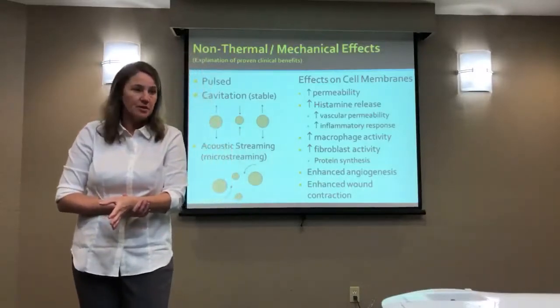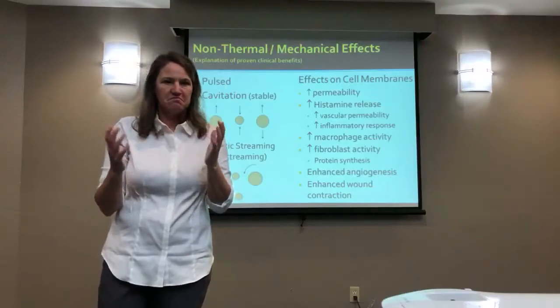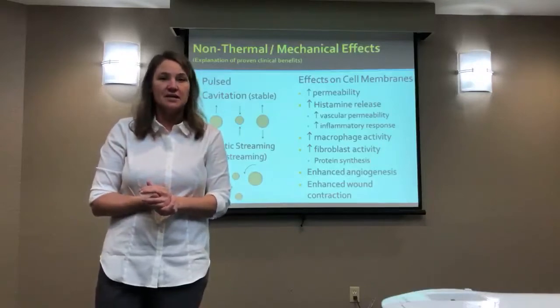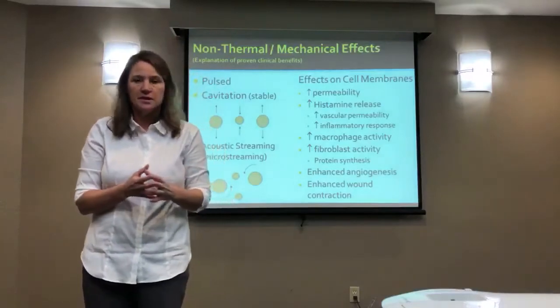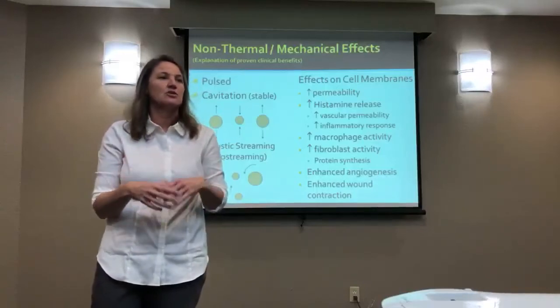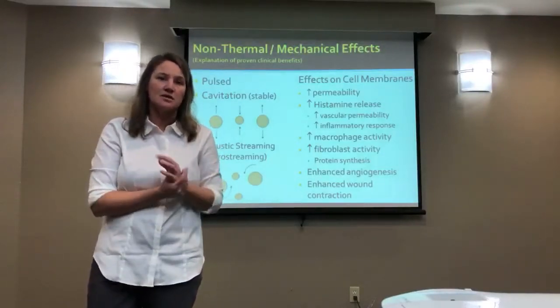There were some really good controlled studies that had been done, and they had done treatments at, say, 1 watt per centimeter squared or 0.5 watts per centimeter squared delivered at a 20% duty cycle. And in the findings, certainly the outcomes were improved. The control group did not improve as much as the treatment group, and it was mostly healing. Tissue had healed faster, it had healed better. The breaking strength of the tissue was stronger. So there was benefit in the healing process.